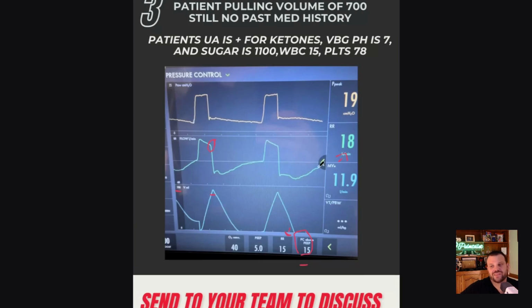So the driving pressure is not like 30, because if the driving pressure was that high, you wouldn't get any flow because you're only pressurizing to a peak airway pressure of 20. So I think the thing you could take away from this is, if you're ventilating with low pressures, you can assume that you're not having incredibly elevated driving pressure, because your plateau pressure is probably not going to be super elevated. Could it be super elevated if the patient's pulling in a tremendous amount of volume and flow and making the plateau very, very high?